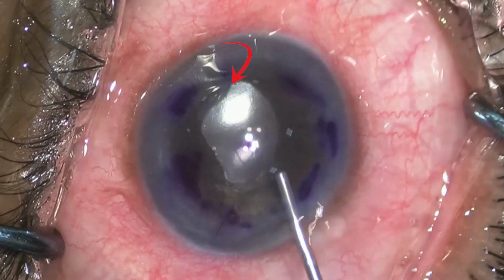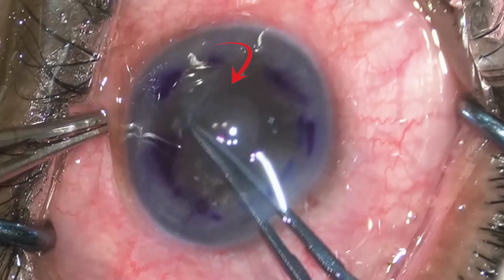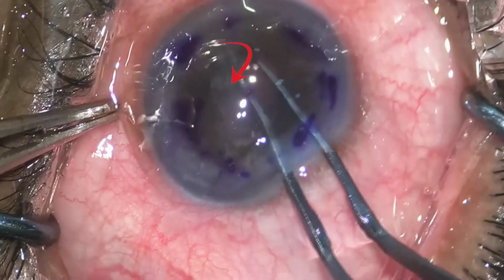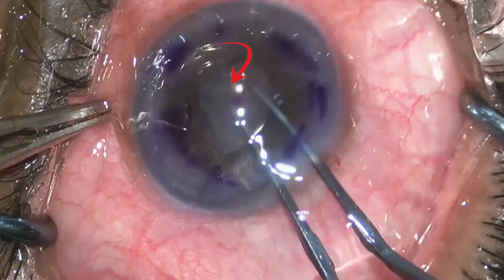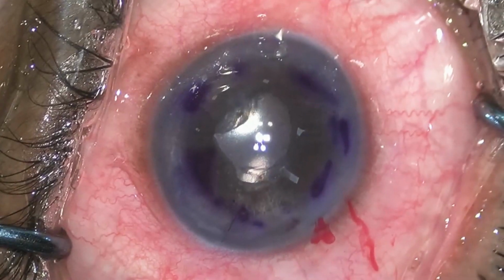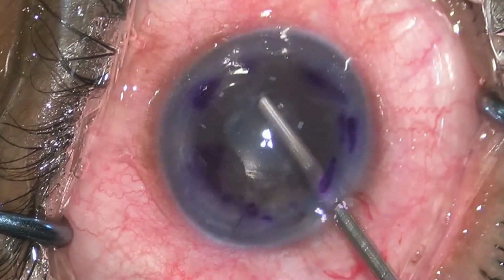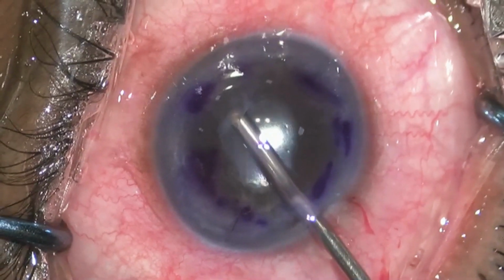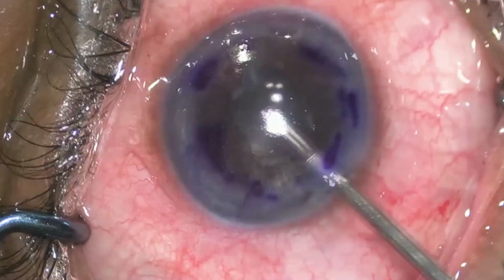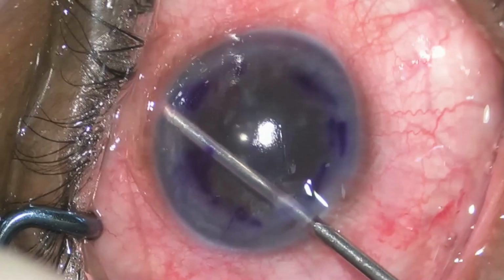One can notice that there is some Descemet membrane still attached at the pupillary margin. An attempt is made to strip the remnant Descemet membrane attached at the pupillary margin. However, it fails to separate. A 20 gauge cutter is used to nibble the edges of the Descemet membrane which is attached at the pupillary margin. It is important because it may hinder the DMEK graft unfolding. Care is taken not to damage the sphincter.